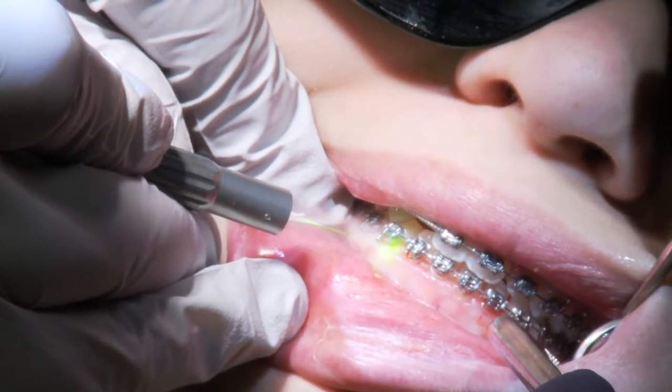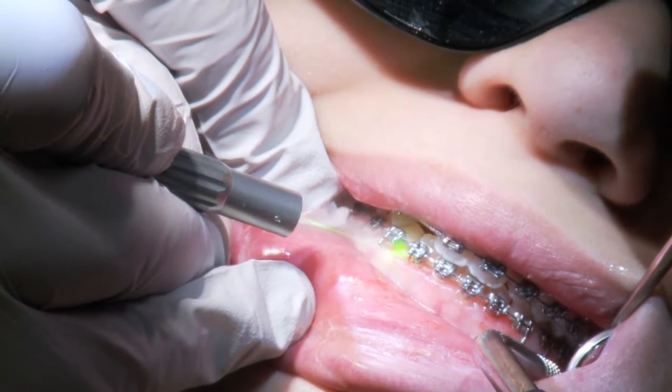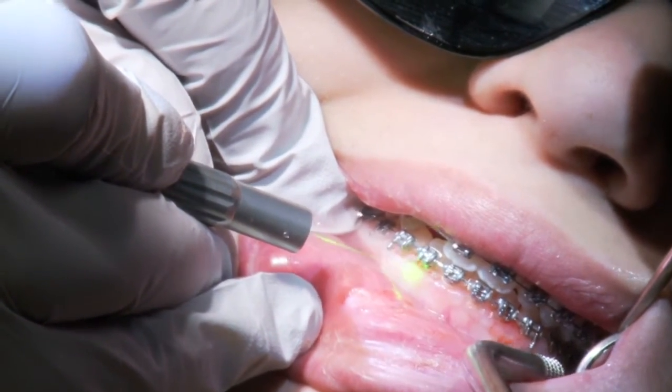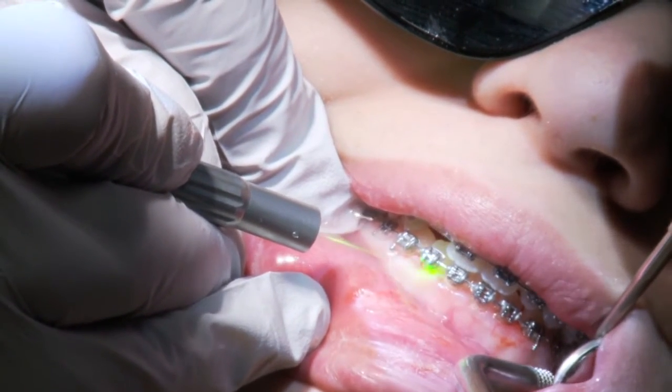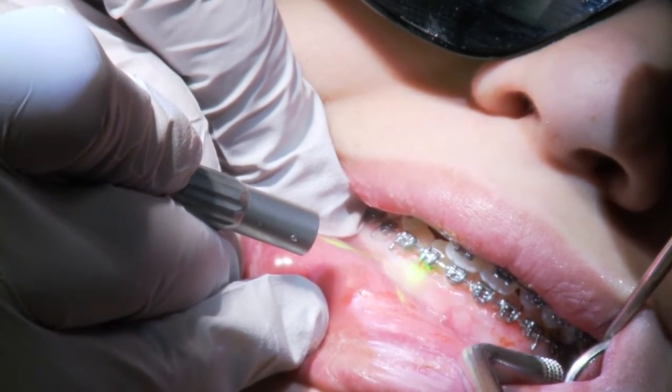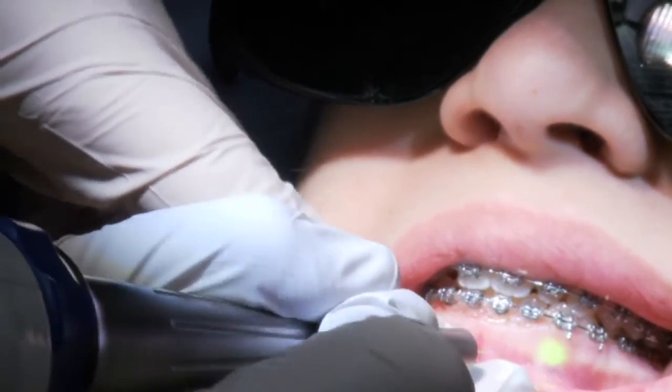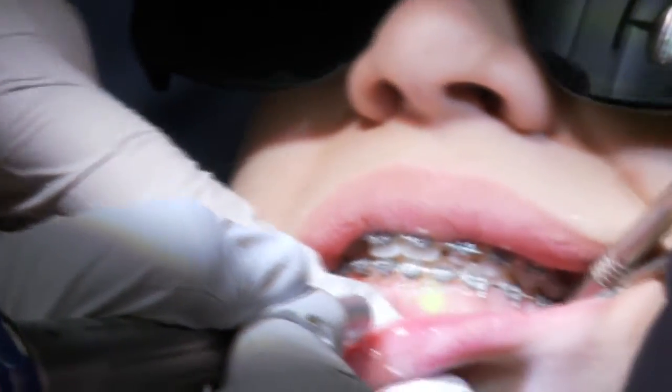We're actually going to be treating about 24 teeth, which is a very large gingivectomy for anybody that's ever undergone one. Three or four teeth can be sensitive — 24 teeth can be extraordinarily sensitive — and I thought this was the better way to do it.